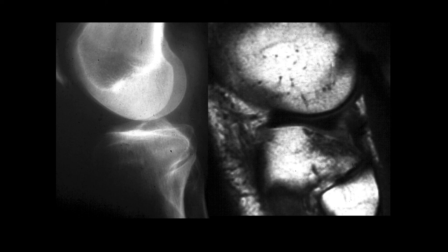Yeah. So he arthroscoped the patient. The cartilage was intact, and it was actually hard to realize that there was a break in the bone underneath it, because the cartilage was intact. So actually, he thinks that he would not have picked this up if he hadn't had the MR scan first. But this was a depressed fracture of the posterior tibial plateau, which he elevated. That's a surgical case.